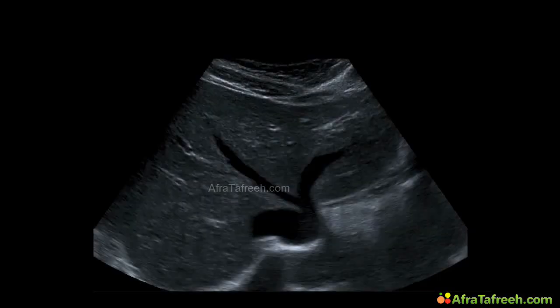We start with the first one, the confluence of the liver veins. Here we see the IVC and three liver veins: the middle one, the left one, and the right one. And remember, the middle liver vein is our border between left and right liver lobe.